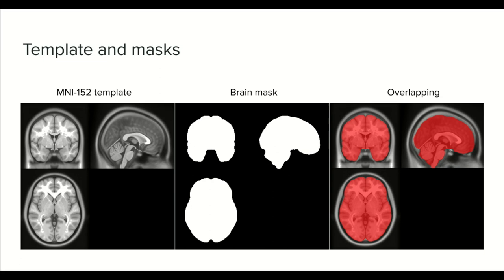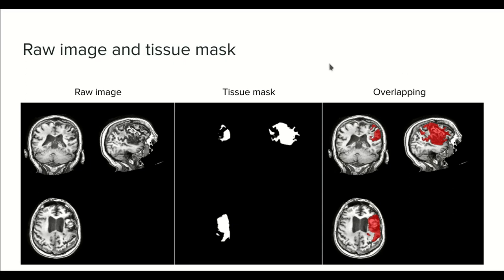A mask can be used to delimit any region. Usually there are masks that delimit only tissue of interest such as a tumor or a lesion. In this example, we have a mask for a brain lesion. The mask itself doesn't make too much sense, but if we overlap both, we can see the regions covered.